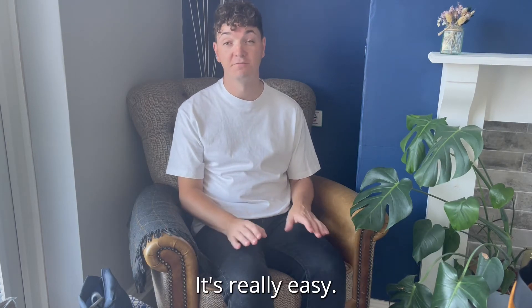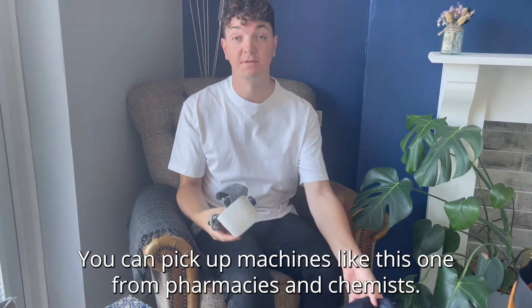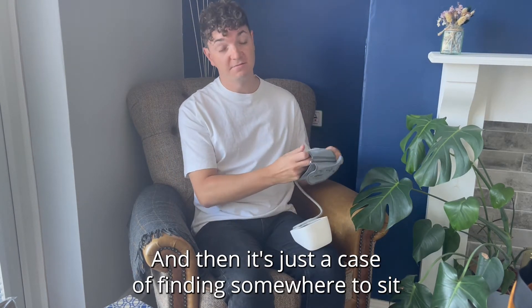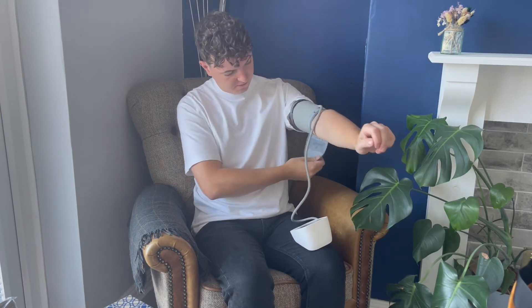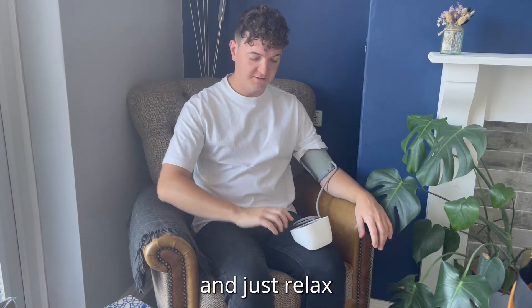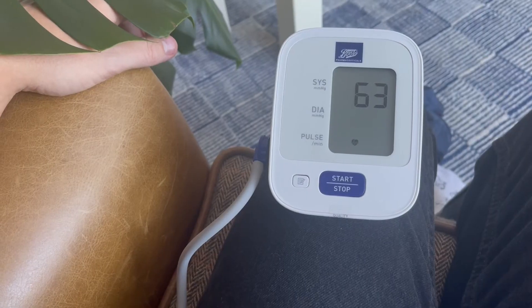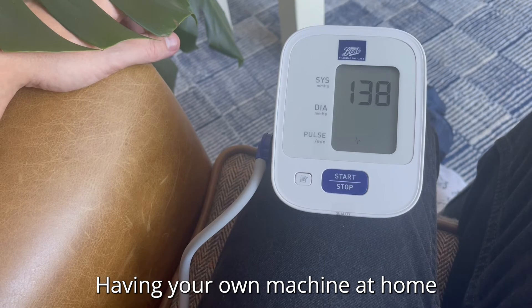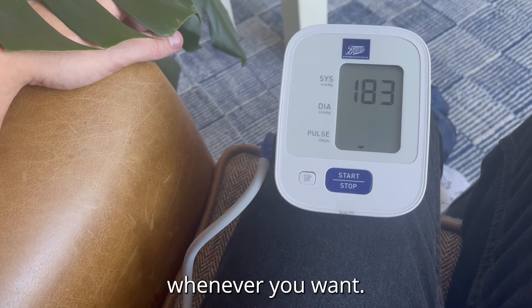You can check your blood pressure at home — it's really easy. You can pick up machines like this one from pharmacies and chemists. Then it's just a case of finding somewhere to sit, put the cuff on, relax, and press start. Having your own machine at home lets you keep track of your blood pressure and any changes whenever you want.